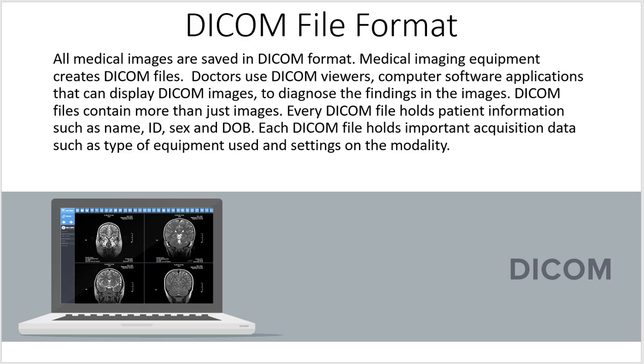Every DICOM file holds patient information such as patient's name, ID, sex, date of birth. Each DICOM file holds important acquisition data such as the type of equipment used and what settings were on the modality. So that data is all embedded inside of the image.